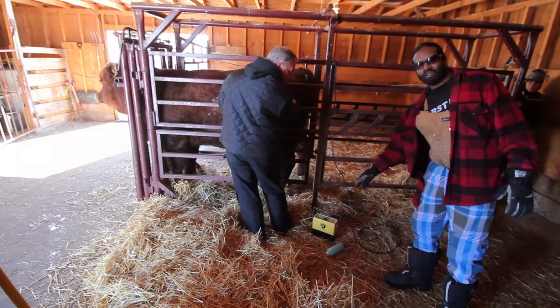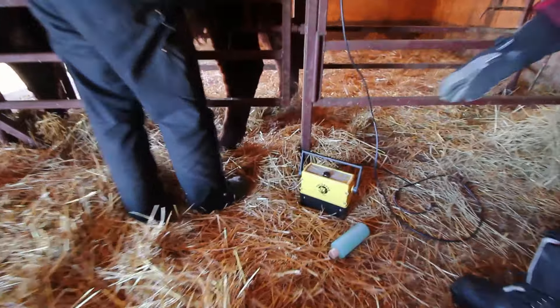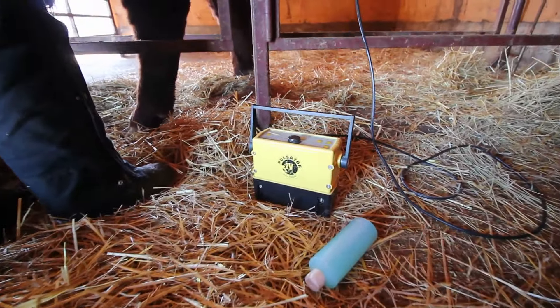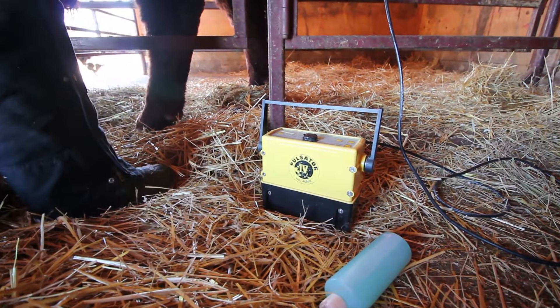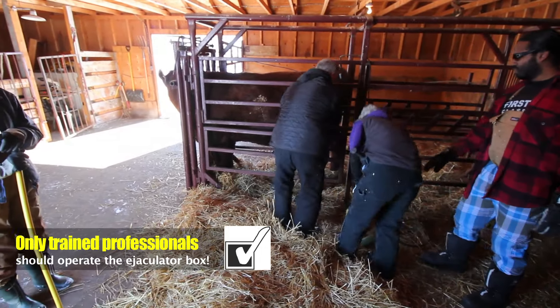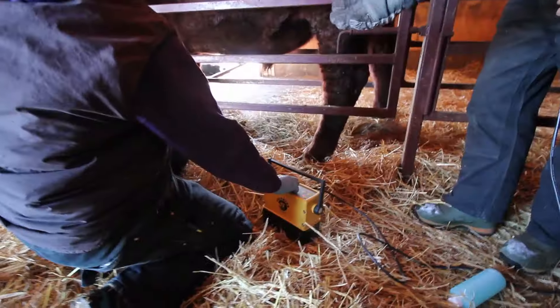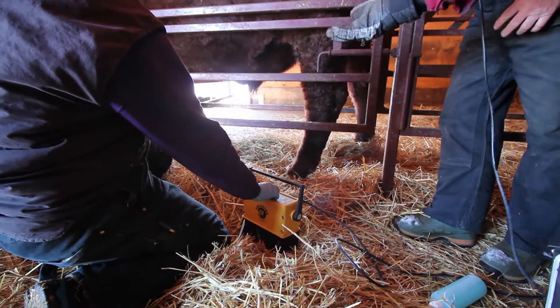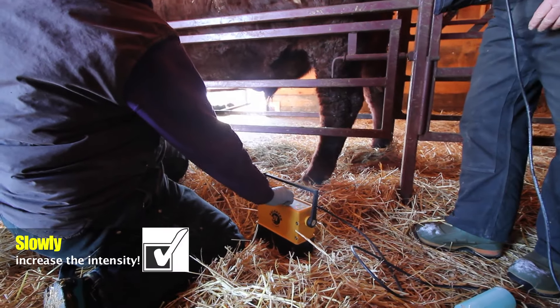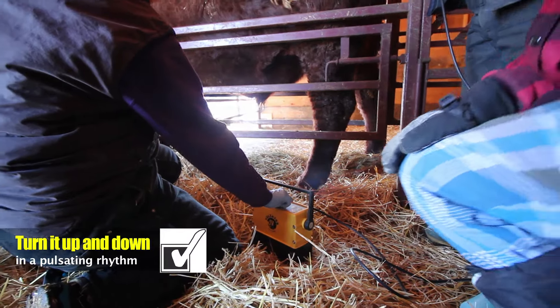So this is the ejaculator box right here — also called the pulsator. Sylvia is now going to operate this box. She has turned it on. Do you gradually increase the intensity? Yes, just slowly turn it up, and then sort of turn it up and down in a pulsating type rhythm.